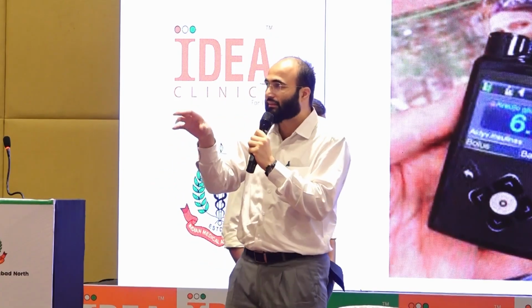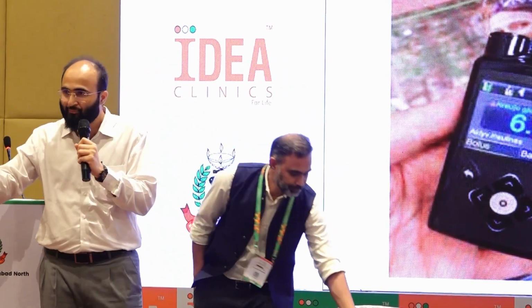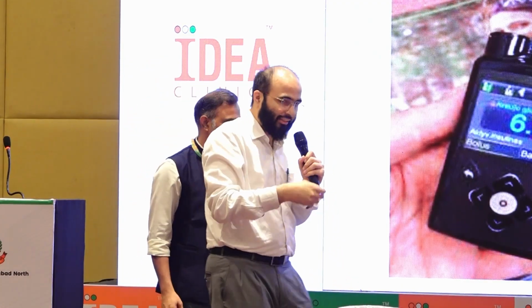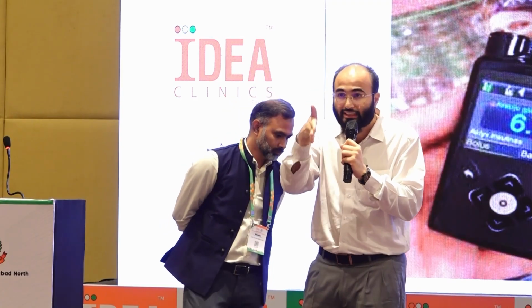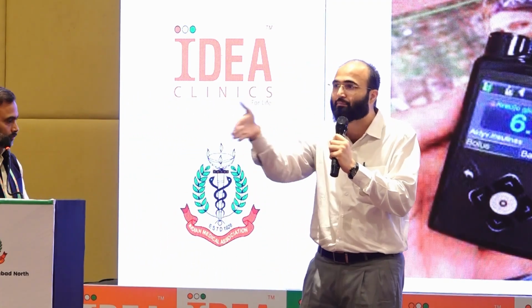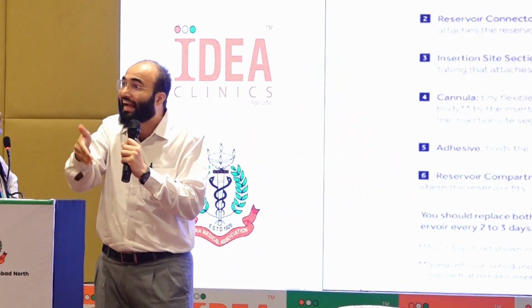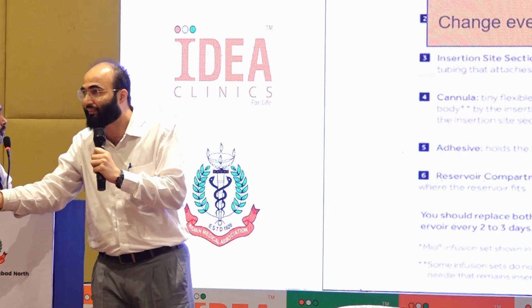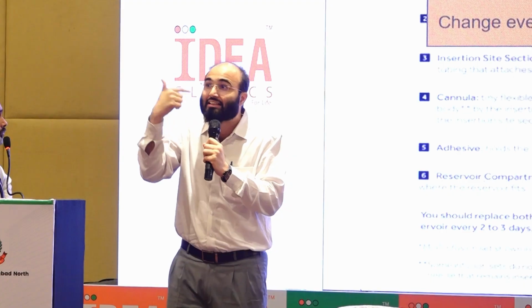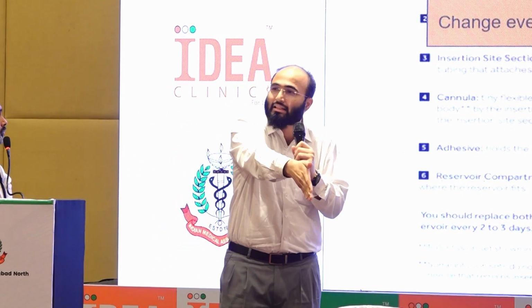There's something called as a smart guard. When you put the pump on automation, the insulin is delivered automatically, and it has now the ability to stop the insulin delivery before low. It suspends the pump before low. Previously, it used to suspend at low. So the patient has already had a hypo, then it stops the insulin delivery. Now it can anticipate that this patient is going to have a hypoglycemic spell, and maybe 20 minutes in advance, it can stop.